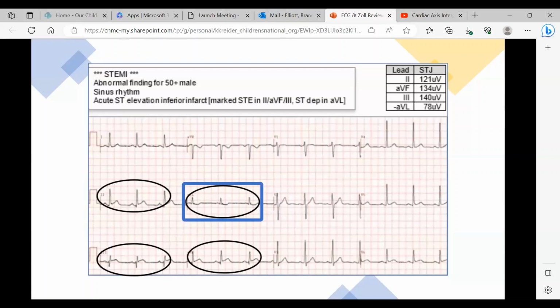Yes. If you have indications of ST elevation, this is a very small section of the right side of the heart that you're looking at. So if you move to V4R, you'll have a better picture and you'll probably see the elevation quite obvious once you move over. So you think V4R would look much bigger elevation? Right.